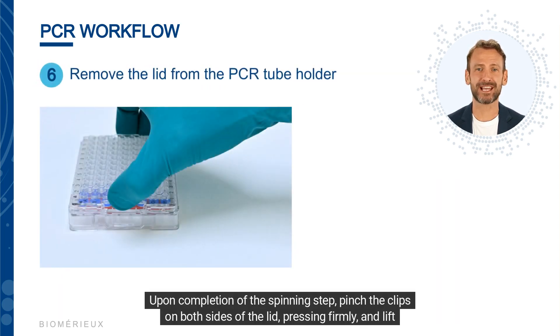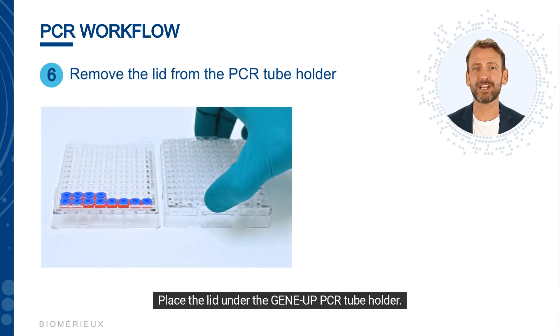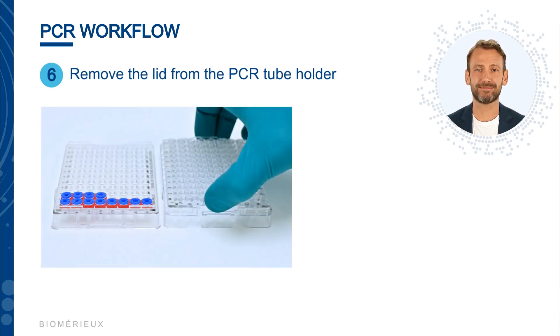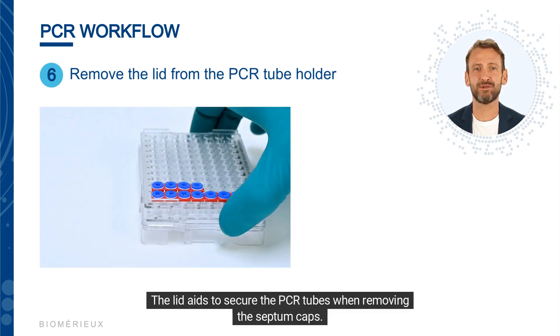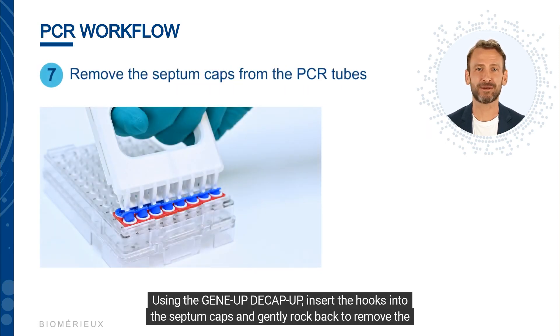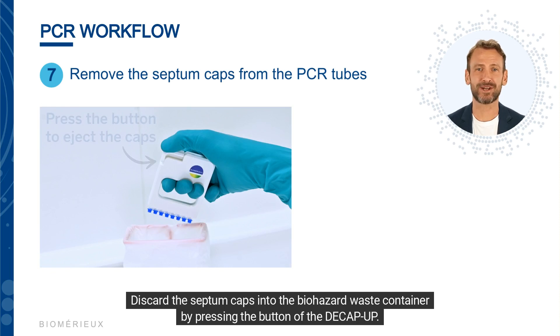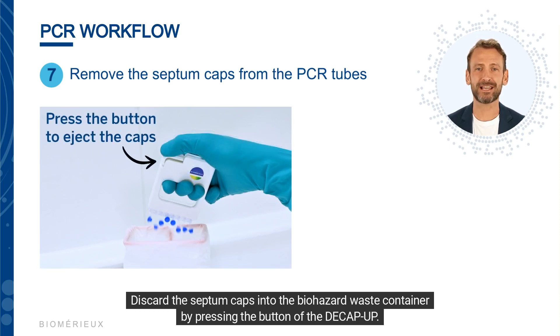Upon completion of the spinning step, pinch the clips on both sides of the lid, pressing firmly, and lift to remove it from the PCR tube holder. Place the lid under the GeneUp PCR tube holder. The lid aids to secure the PCR tubes when removing the septum caps.